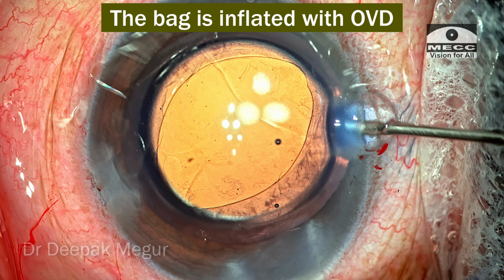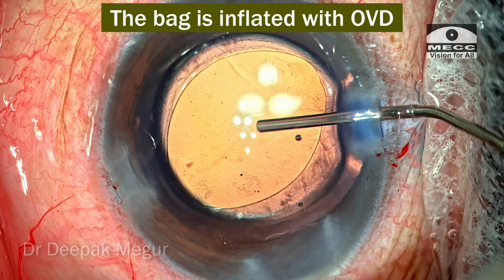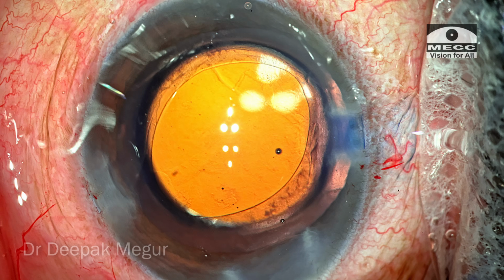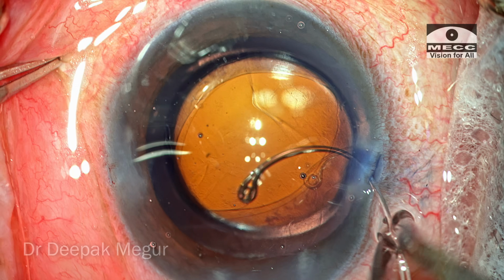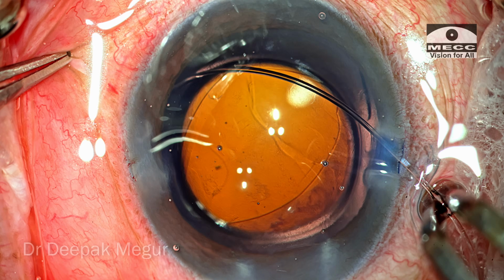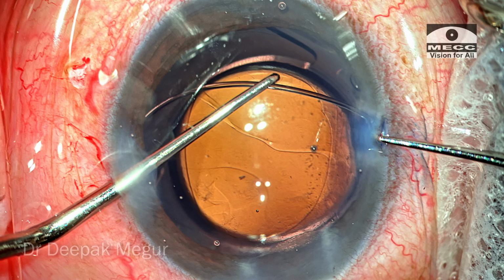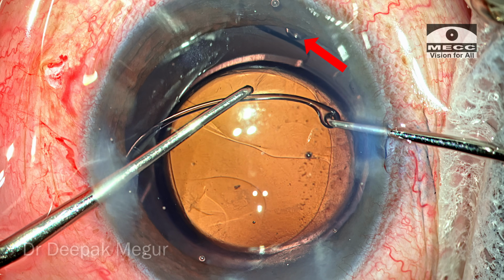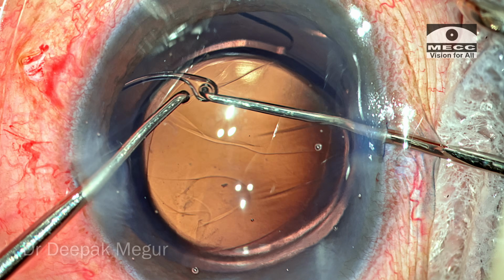And before putting the ring, the bag is inflated with OVD so that I create some space and I don't damage the equator of the capsular bag while trying to nudge the CTR around. Once the space is created with the OVD, the CTR is then gently maneuvered under the rhexis margin, and finally the entire 360 degrees of equator of the bag is supported well.